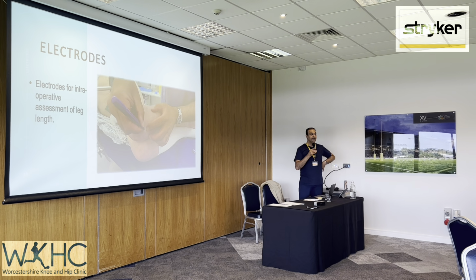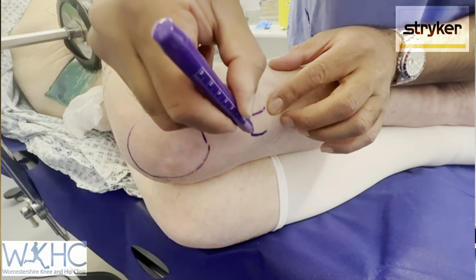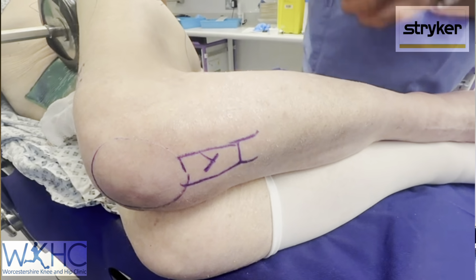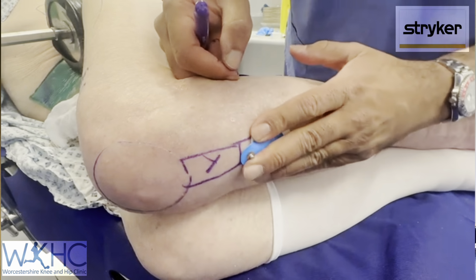Now for the hip, you have to put a reference point on the knee. That reference point is an electrode which you reference off in order to work out your leg length. So we recommend that you be careful where you put this electrode, because you have to put it on a firm point. So put it on the tubercle or put it on the actual patella.